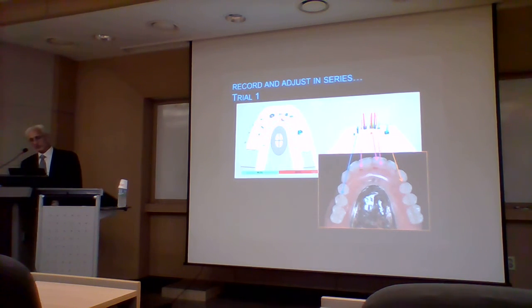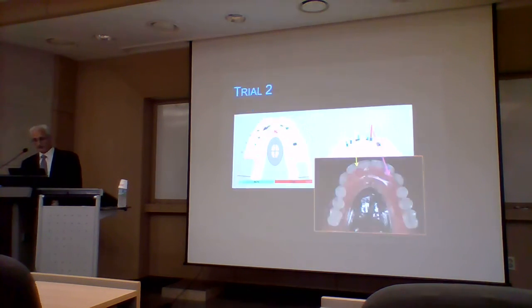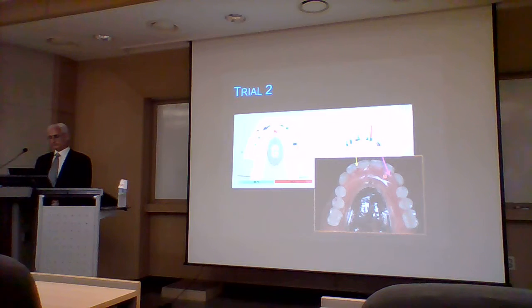So in the first try in that delivery, there's very high pressure where the ERA and the natural tooth root are, and you can see fairly sizable paper marks there. And then we adjust that, and then we have new high forces to treat. 두 번째로는 먼저 많이 났던 데는 없어지고 상대적으로 다시 높게 찍히는 부위, 프레셔가 걸리는 부위가 나타난 거죠.